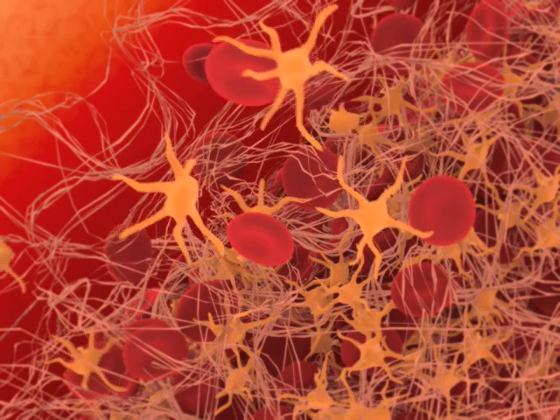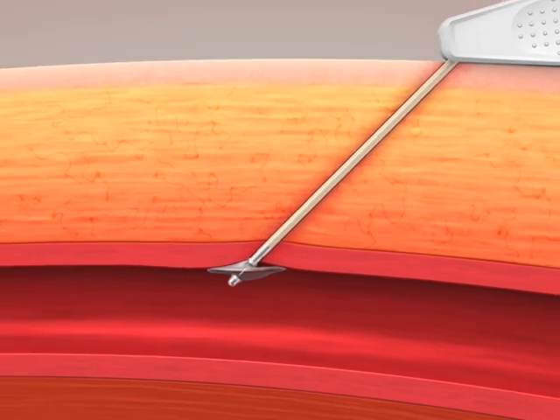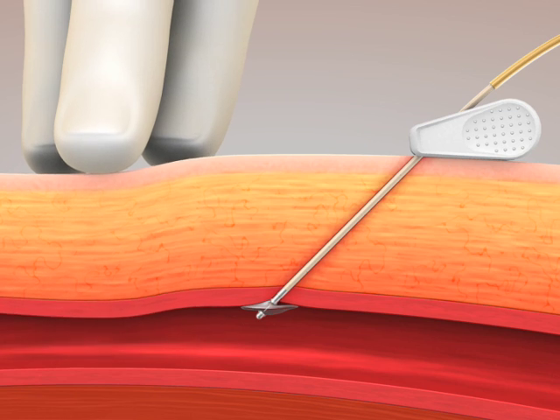The coagulation process continues to propagate throughout the local environment. Prior to removal, the artery is located proximal, superior to the Cardiva catalyst clip. Apply and maintain occlusive pressure to the artery.